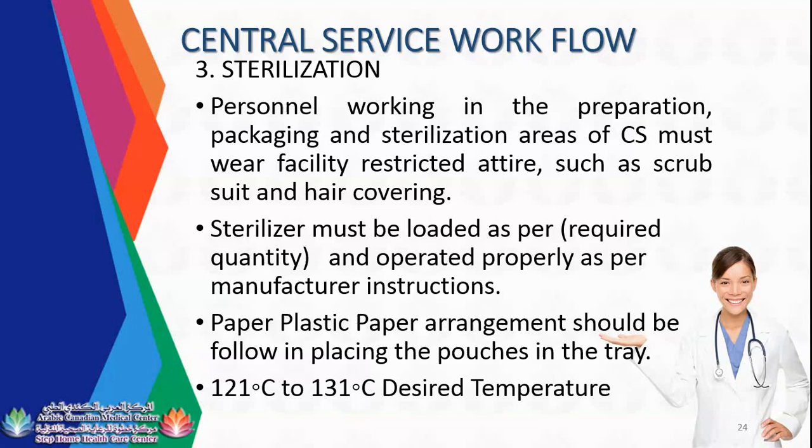The sterilizer must be loaded as per the required quantity and operated properly as per the manufacturer's instructions. The paper-plastic arrangement should be followed in placing the pouches in the tray. Paper-plastic, guys, means the paper side should be on the bottom and the plastic side on the upper part.